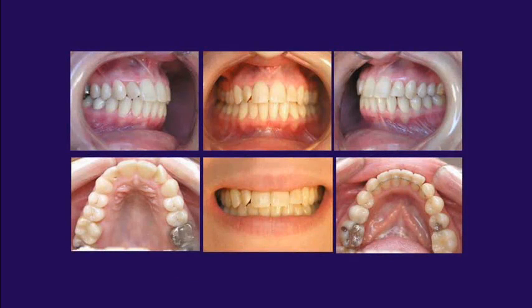So here's our case with our gal that had just the upper lateral incisor very rotated. That was her main concern, was not concerned about the lower lateral incisor crowding, and it wasn't causing an interference either for me to move the upper teeth. So we treated her upper canine to canine so we could alleviate that crowding and correct that rotated lateral incisor.